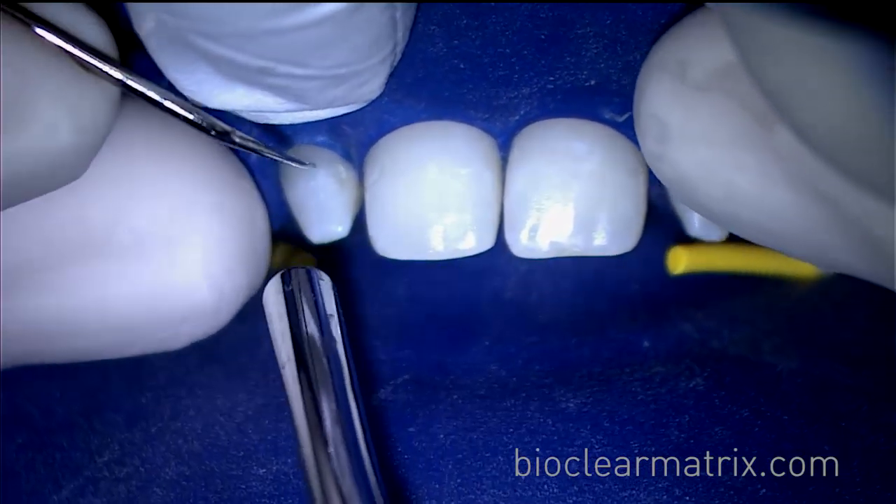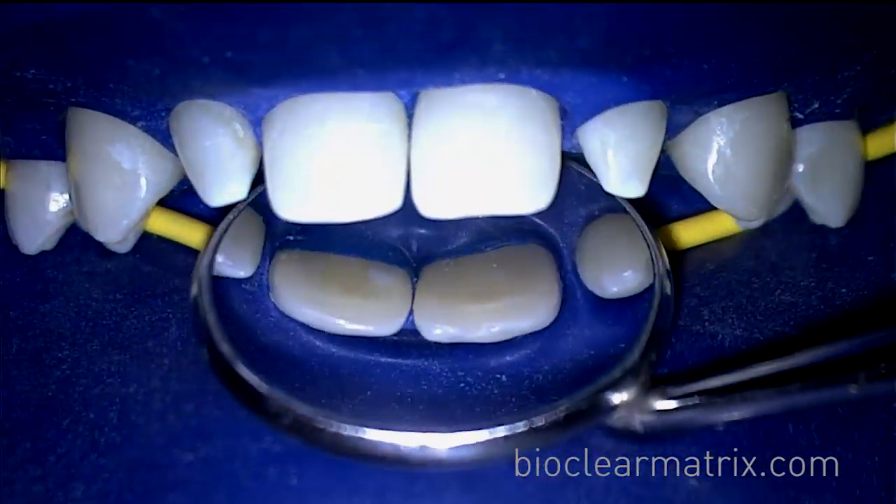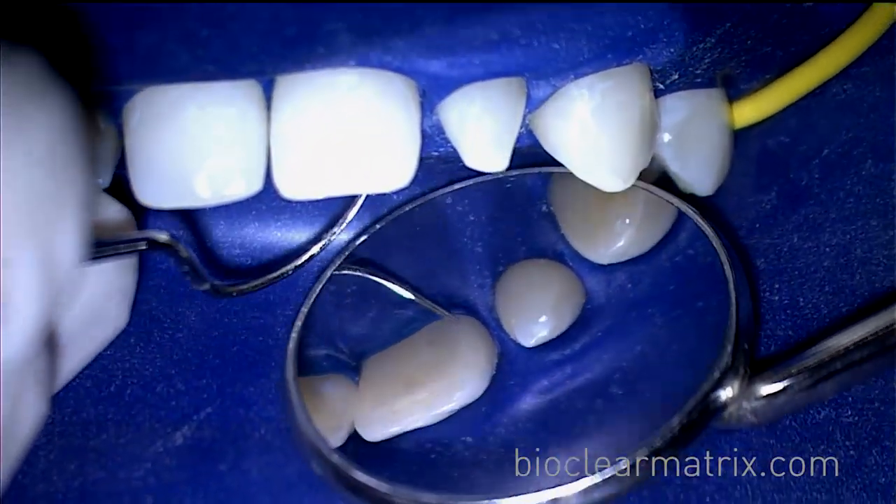Tucking the rubber dam is a very important step in the BioClear matrix process. The tucked rubber dam seals the gingival margin of the matrix.